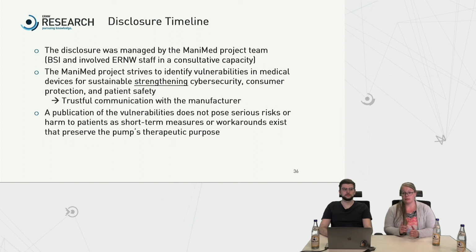However, it has to be ensured at all times that the publication does not pose serious harm to patients. In our case, short-term measures and workarounds exist and existed, and an innovative device was not withdrawn from the market. So I believe that security and safety are not contradicting each other, and that secure connected devices are pioneering.